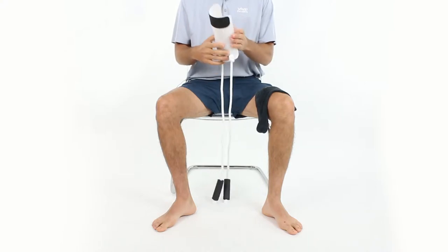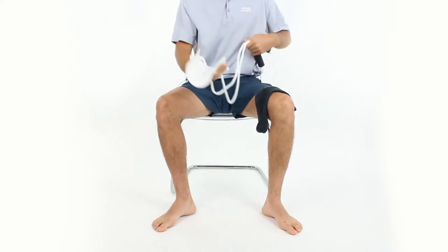Hey, this is Joe with Vive Health, and I'm going to show you how to use the Vive Sock Assist. I have my Sock Assist by Vive here, and I'm going to explain it a little bit.